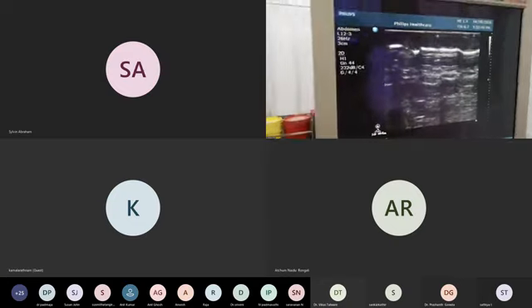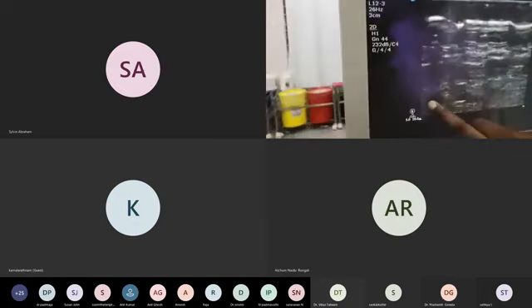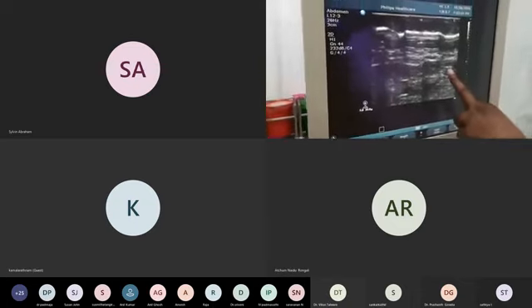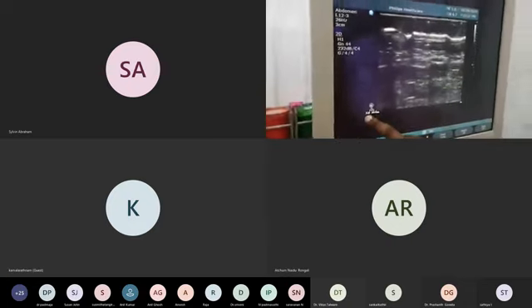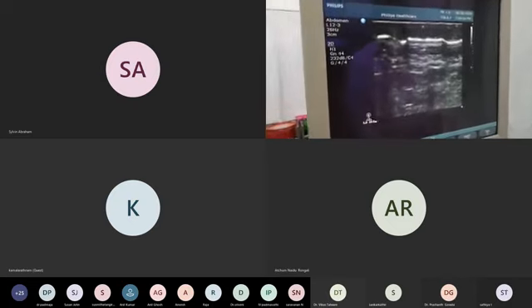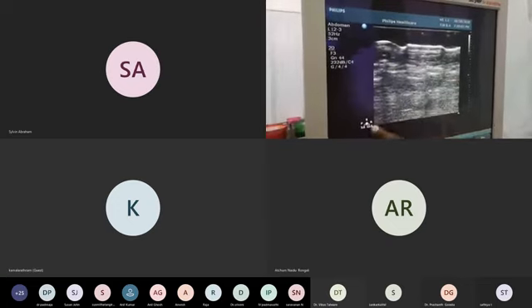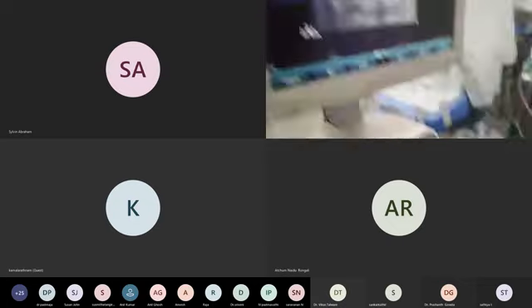And suppose here there is something. Can you see 5, 10? Here the frequency is very high on this side. That means here you might get very good quality. So here you might get low quality, 5. You can see this 5 and 10. So if you want to adjust, what you have to do, see this. Here it has become more smooth because the hertz is very good. So this side is very bad.